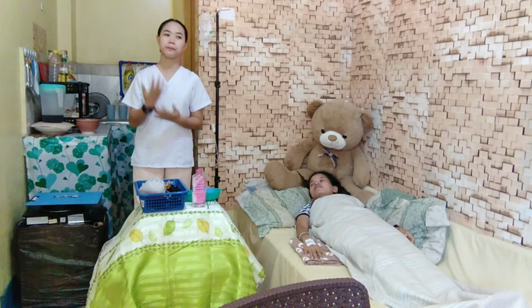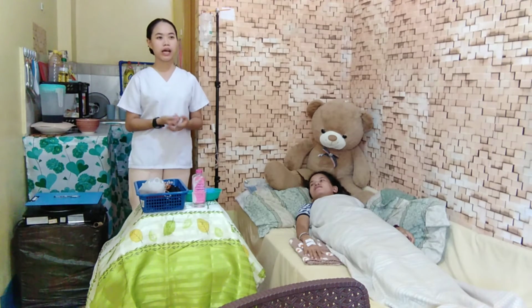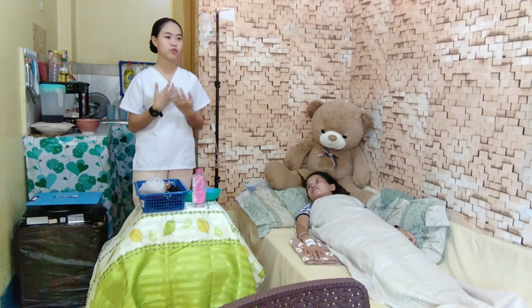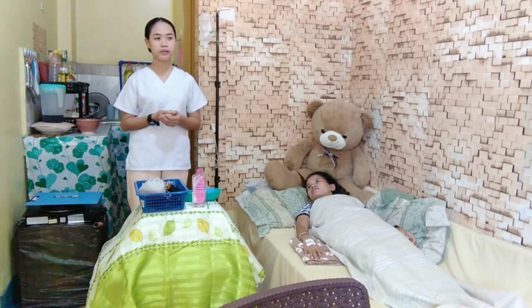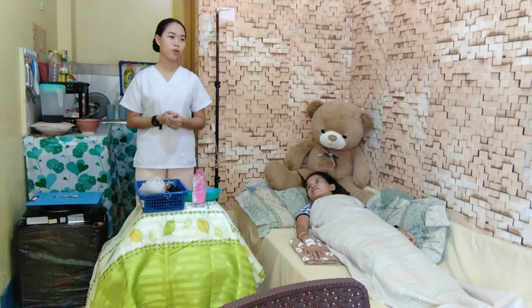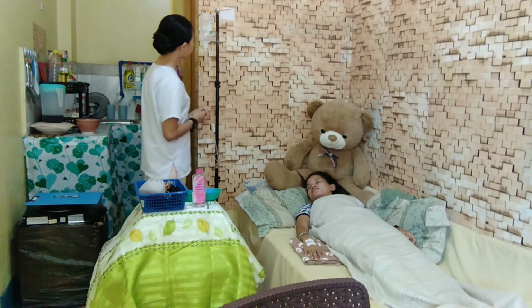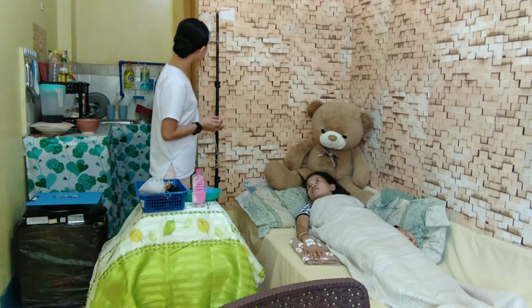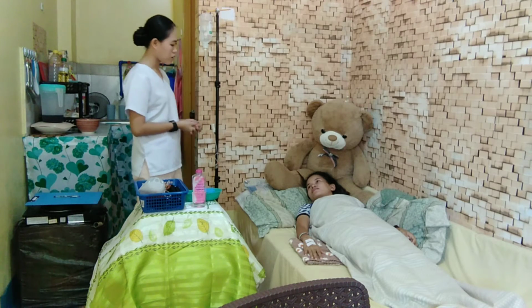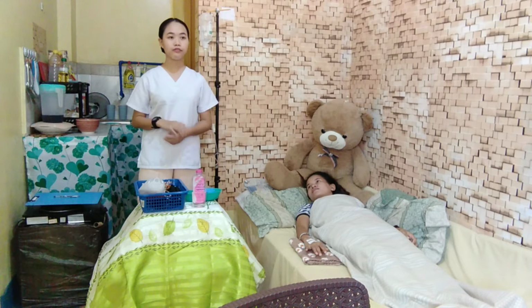And then we will check the patient's history of transfusion, if there were any reactions, any reasons for the present transfusion, and so on. As you can see, the patient has an infusion right now of normal saline 0.9% on her left arm.